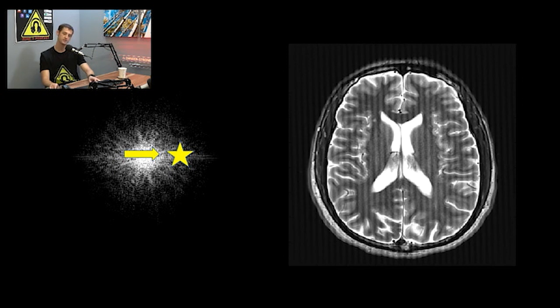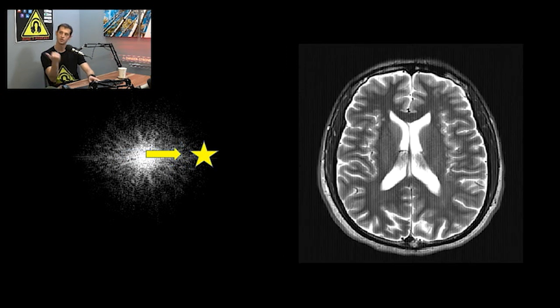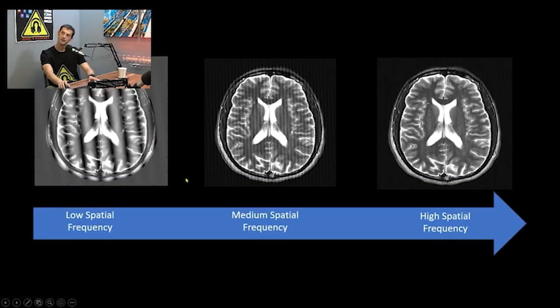And then lastly, if we move it out one more notch, way out there, it's even a little bit tighter. It's like the highest spatial frequency. And so on the left, you have this.